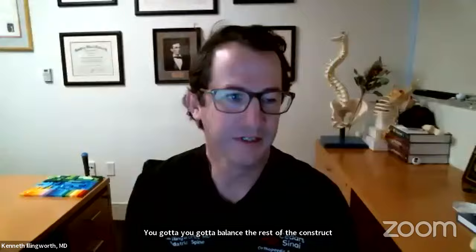Like you said, balance is the key. You've got to balance the rest of the construct based off of where you've locked this in now. It could be easy, if the spine allows, to overcorrect more of that thoracic spine and then tilt her back more.